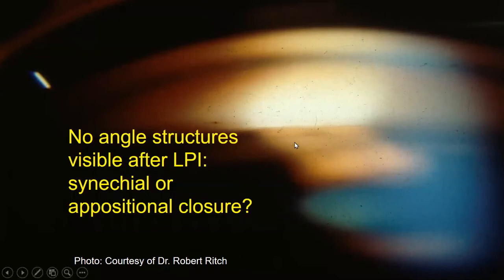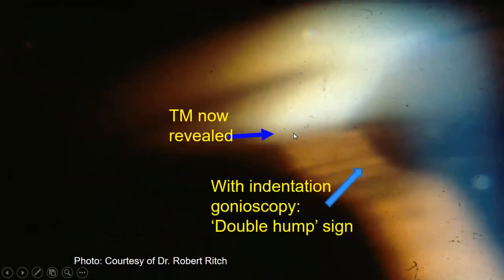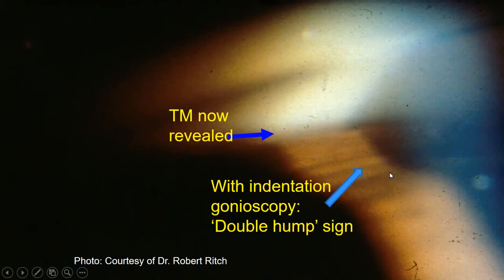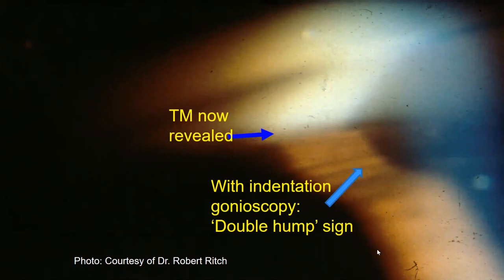In this gonioscopic view of the angle, you can see that there are no visible angle structures. Under these circumstances, we would next decide whether this is synechial or appositional closure, and we can then perform indentation. With indentation, the angle has opened up with the trabecular meshwork revealed, confirming appositional angle closure. In this particular eye, you can also see a very distinct double-hump configuration of the anterior surface of the iris. This is because a very prominent and anteriorly positioned ciliary body is pushing against the peripheral iris — a very classic example of plateau iris configuration. The other hump, more anterior and central, represents the iris draping over the anterior surface of the physiological lens.